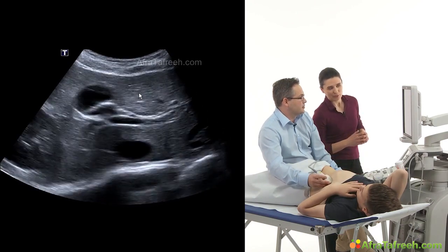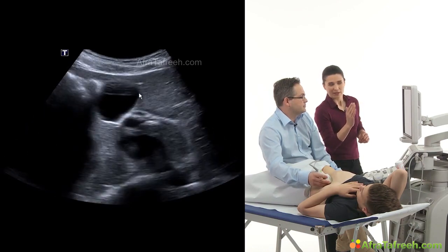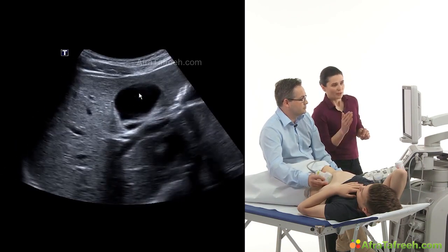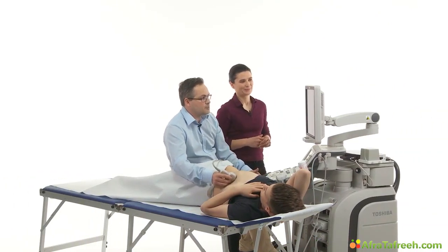I prefer the other view because I like to make a sweep along the costal arch and orientate on the lower border, on the caudal rim of the liver, to get a good view of the gallbladder. That's my preference. So you can use both of them and decide what's best for you. So this was not so difficult.